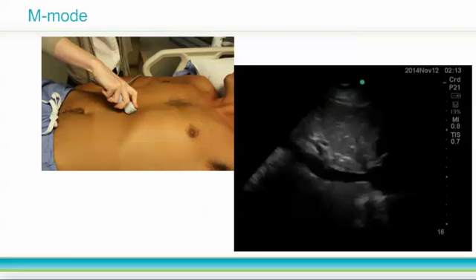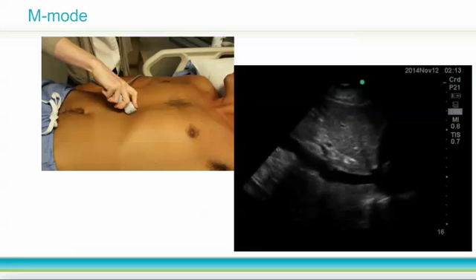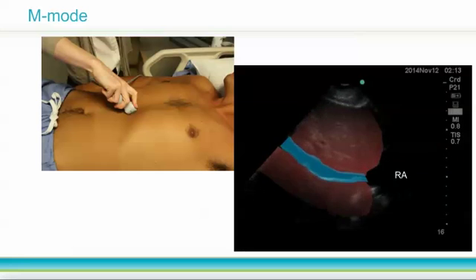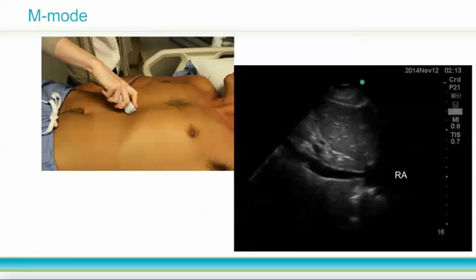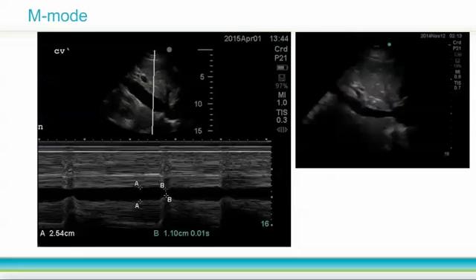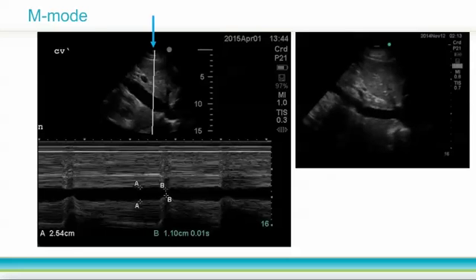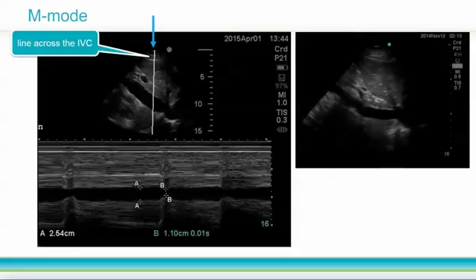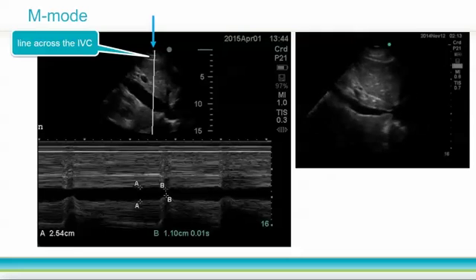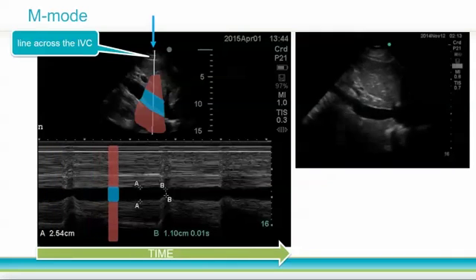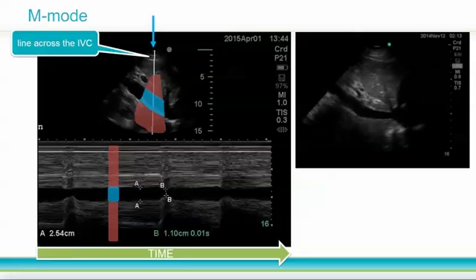All of the images we've seen so far are 2D, or B-mode ultrasound. We sometimes also use M-mode ultrasound, which shows the motion over time of structures seen in a single axis. Here, an operator is scanning a patient's inferior vena cava, or IVC, as it enters the right atrium of the heart. We can see that the IVC diameter changes with respiration, and we'd like to quantify that change. In M-mode, we've drawn a line across the IVC just proximal to where it enters the right atrium. At the bottom of the screen, we see the same structures that this line crosses and can watch them move over time. The vessel walls move closer and farther apart as the patient breathes, and we can measure the distance between the walls with calipers — note the A marks are much further apart than the B marks.